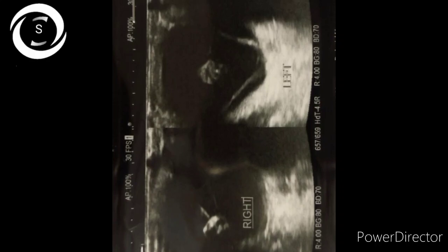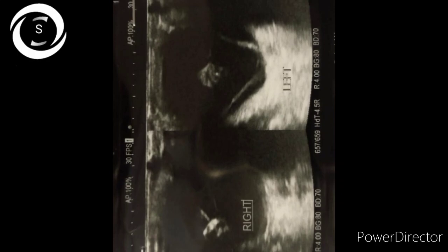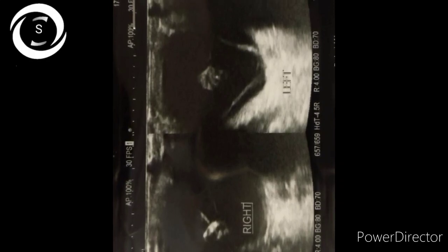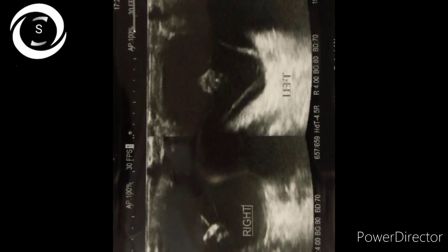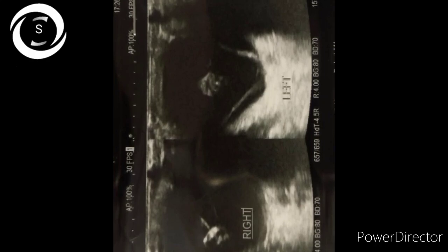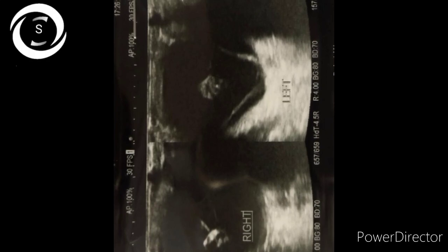So this B scan shows the vitreous and retina of both eyes, and there are hyperechoic round shadows in the posterior vitreous that depict the posterior dislocation of crystalline lenses in both eyes, and there is retinal detachment in the left eye which is attached at the optic disc.